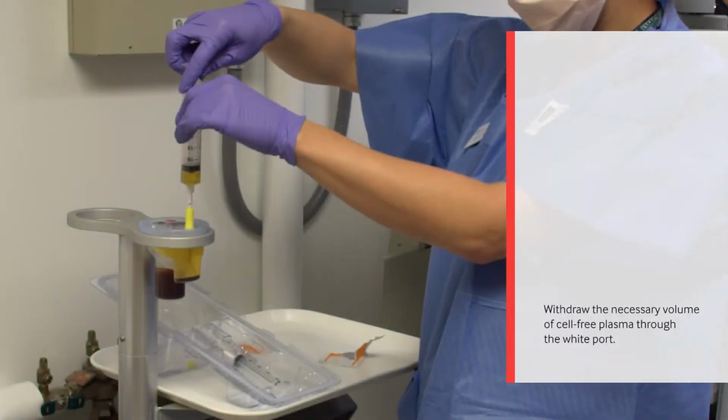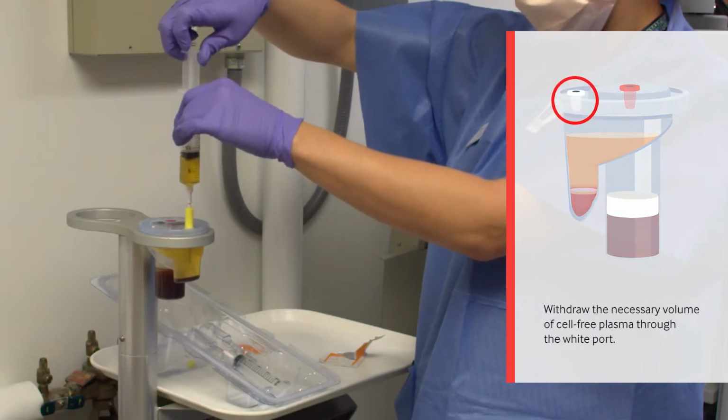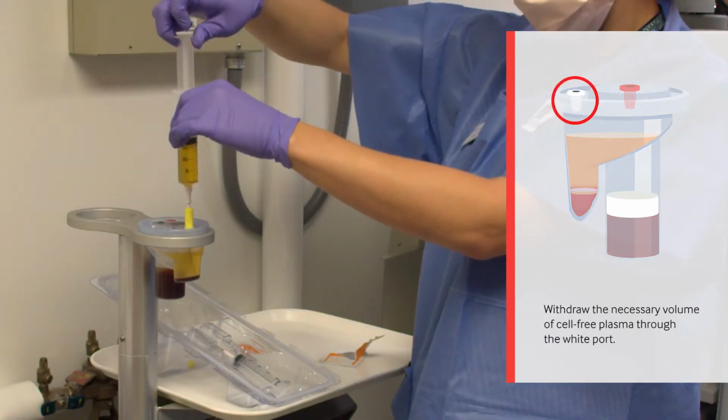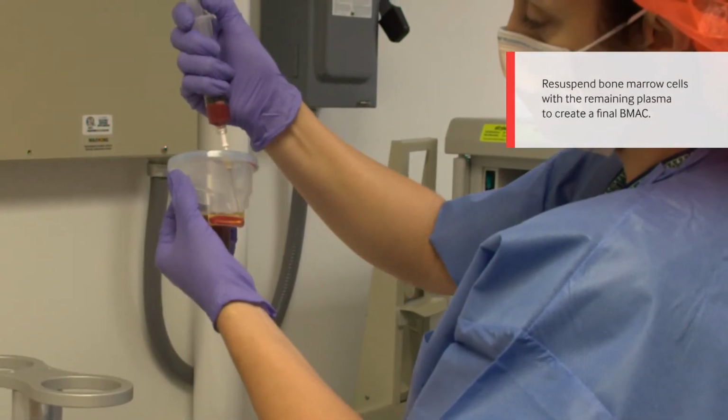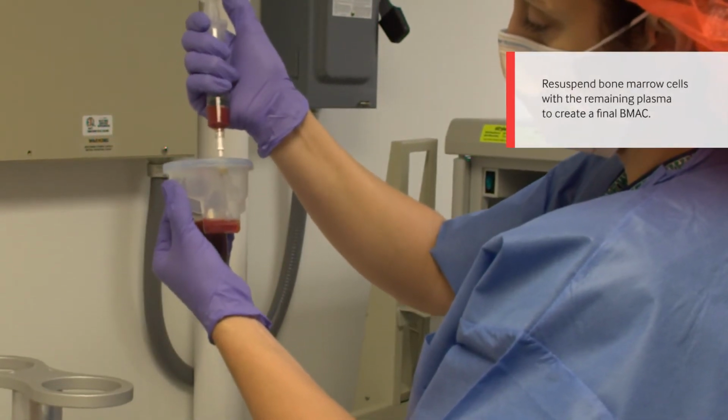Using a syringe with 1 or 2 yellow spacers, withdraw the necessary volume of cell-free plasma through the white port. Resuspend bone marrow cells into the remaining plasma to create a final BMAC.